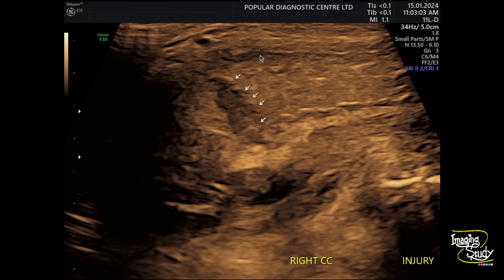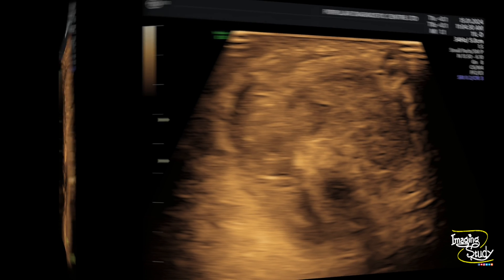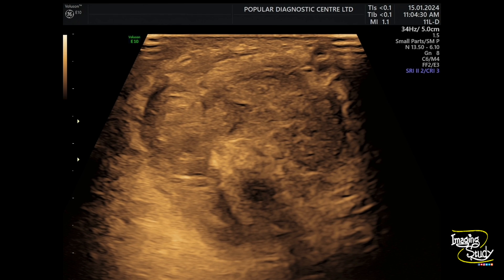You can see the right corpora cavernosa showing the hematoma on long section. And here is the transverse section showing the peri-albugineal hematoma having communication with the right corpora cavernosa at the root of the penis.